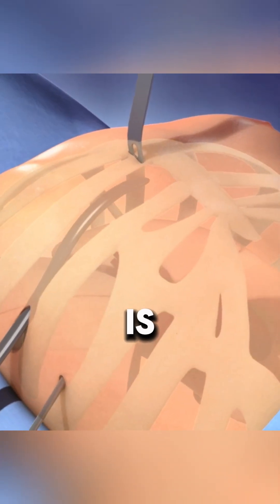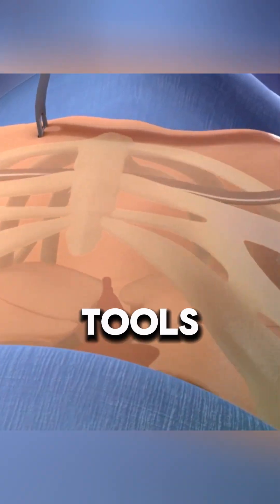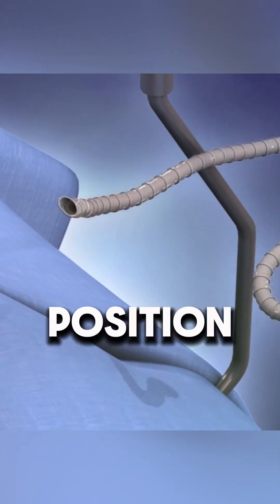Chest expansion: the bar is rotated using specialized tools, immediately lifting the chest into a normal position.